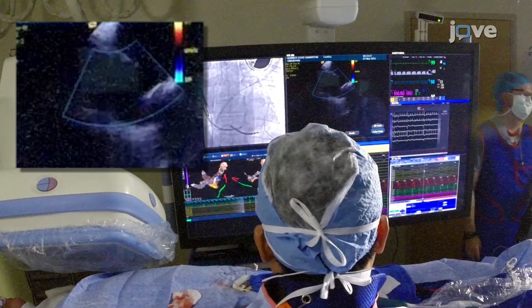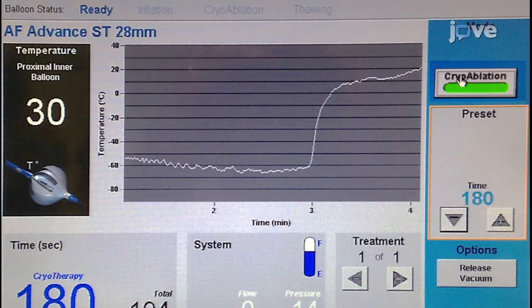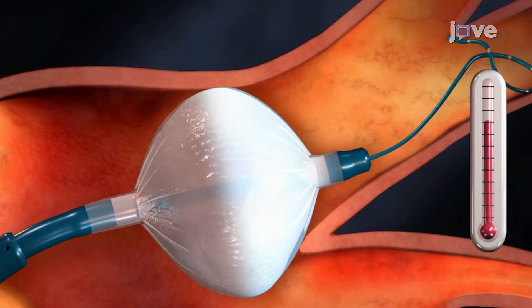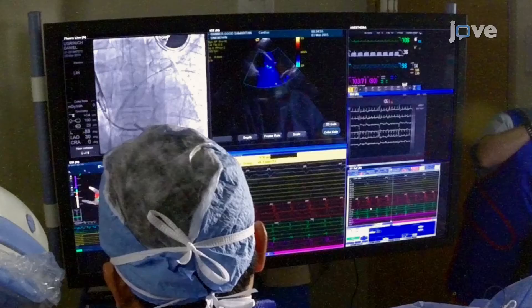Once occlusion is established, start the cryoballoon cryoablation by pressing the start button on the cryoconsole. This will push cryorefrigerant into the cryoballoon catheter and initiate cryoablation. On the right-sided PVs, insert a diagnostic catheter in the right atrial superior vena cava junction and position it to pace the right phrenic nerve.